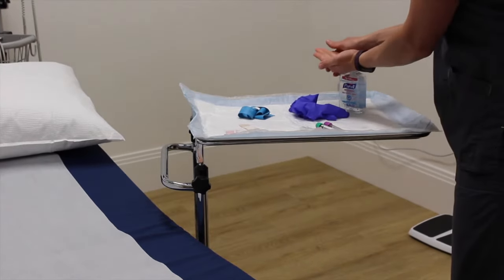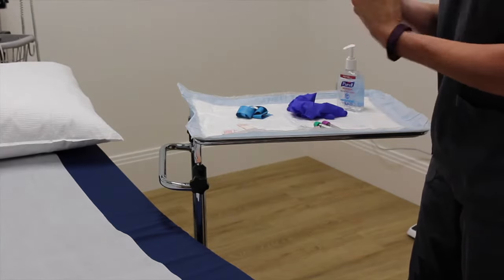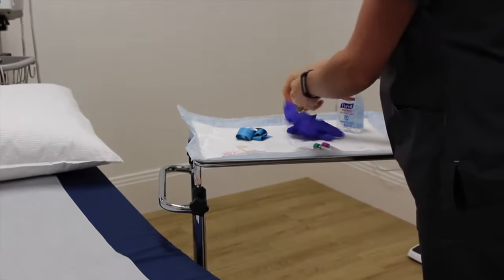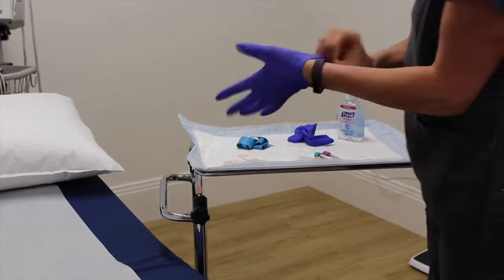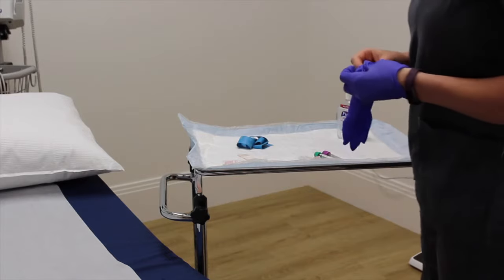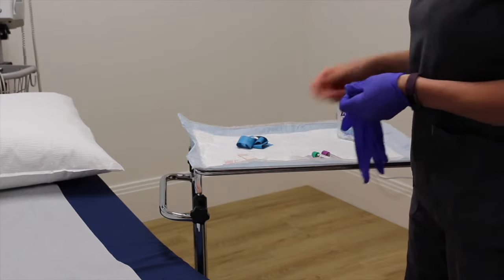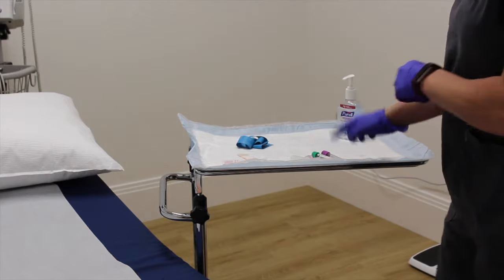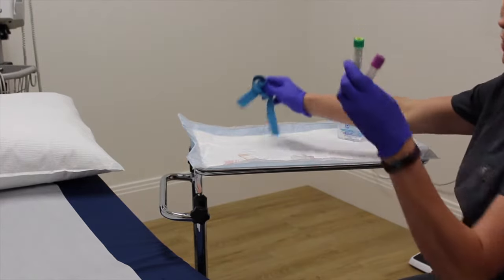All right, so we're going to draw some labs. I'm going to go ahead and wash my hands first, or apply alcohol, and you always want to do this in front of the patient. Then you're going to put your gloves on. I've prepped for my procedure, so I've got my tourniquet, a Band-Aid, a cotton ball, an alcohol wipe, the tubes I need to draw my blood in, my vacuum container, and my Luradaptor with the needle. I've already dated and put date of birth, my patient's name on my tubes.